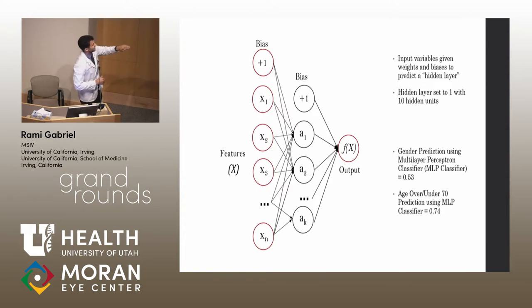And then the second is the layer. You basically assign a weight to all those inputs, and then you assign those weights into the middle node. And so you create this network, and then those weights go on to the final output. That's where the neural network comes in, in that each one of these is like a neuron.